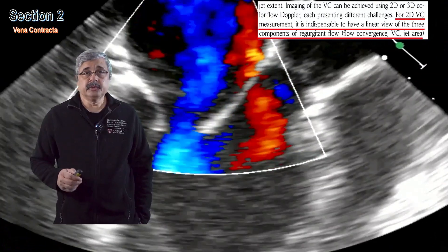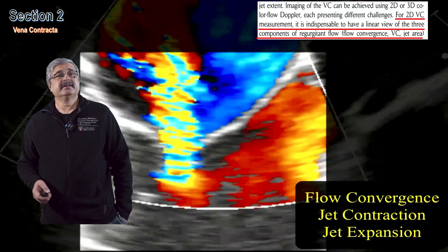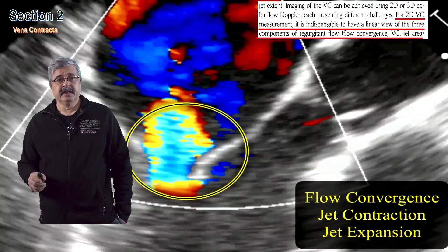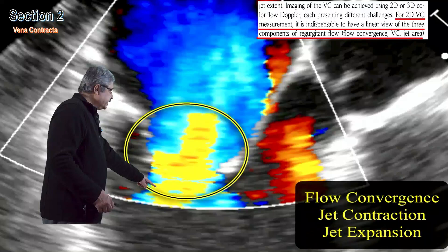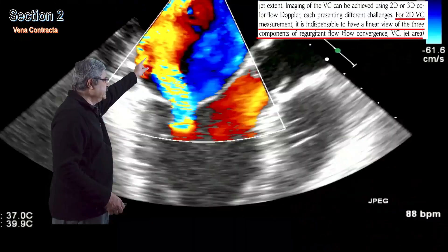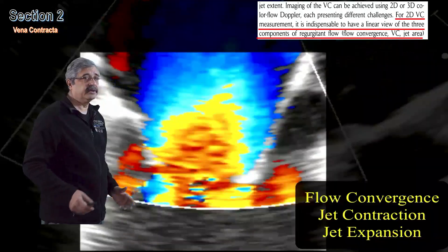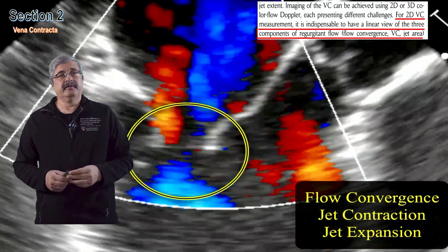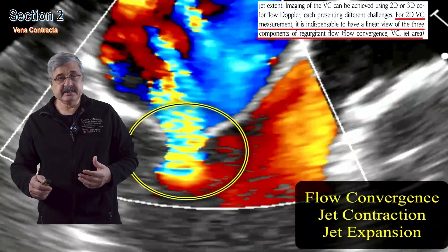For two-dimensional vena contracta measurement, as shown in this graphic, it is indispensable to have a linear view of all three components — flow convergence, flow contraction, and flow expansion. As you can see in this example, this portion demonstrates flow convergence, this demonstrates flow contraction, and up here is the flow expansion in the left atrium. For an accurate measurement, these three components must be demonstrated in the same frame.